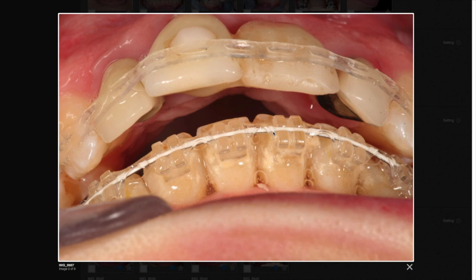Here's a photo to illustrate how much space I actually managed to get. Now, there's something really cool we're doing on the top teeth. Budget was a bit of an issue with this patient and we couldn't do fixed upper and lower, although that would have probably been most ideal. But all we really need to do with the upper front teeth is just pull them back, just retract them in. The spaces are already there. It's just a tipping motion and I don't need to be that accurate because we're going to change it for a crown and bridge later anyway.